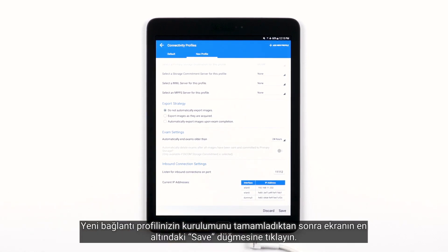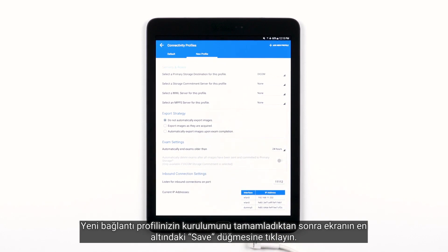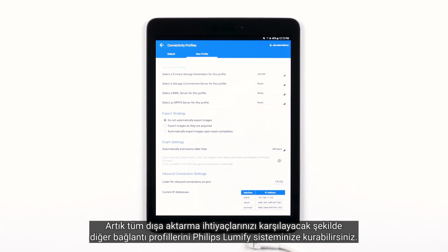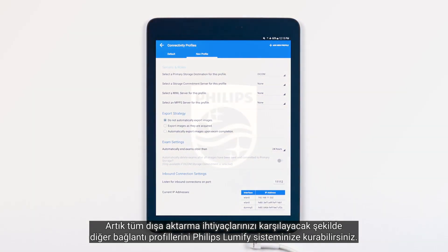Once you are finished setting up your new connectivity profile, tap Save at the bottom of the screen. Now you can go in and set up other connectivity profiles in your Philips Lumify to cover all of your exporting needs.